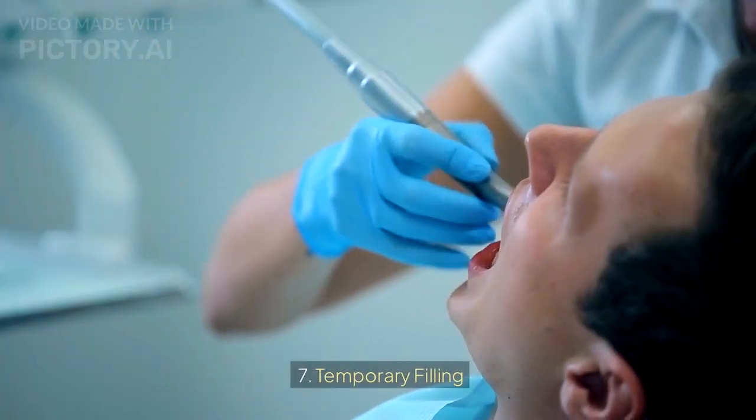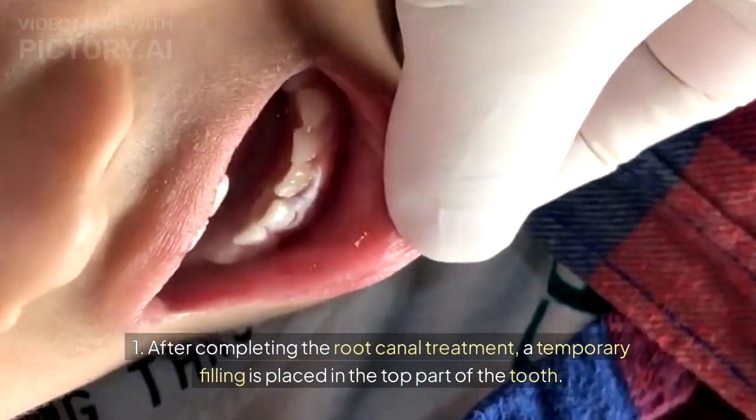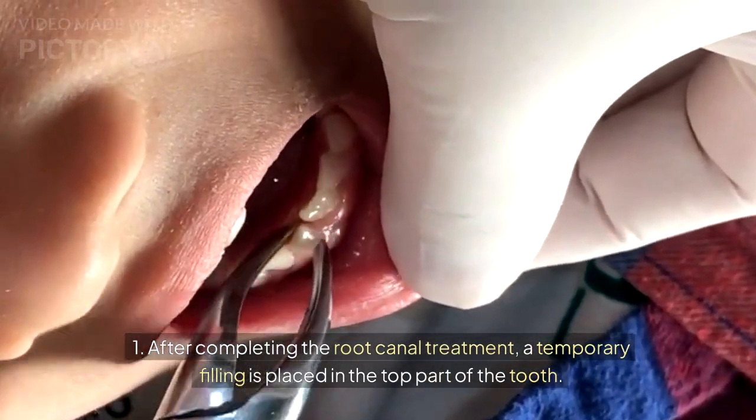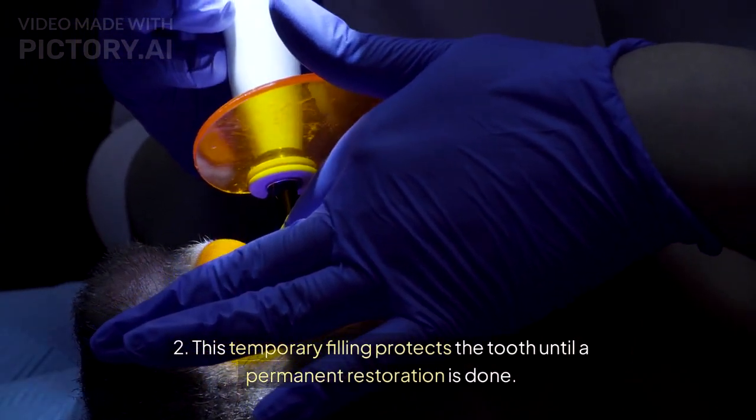7. Temporary filling. Placement of temporary filling. After completing the root canal treatment, a temporary filling is placed in the top part of the tooth. This temporary filling protects the tooth until a permanent restoration is done.